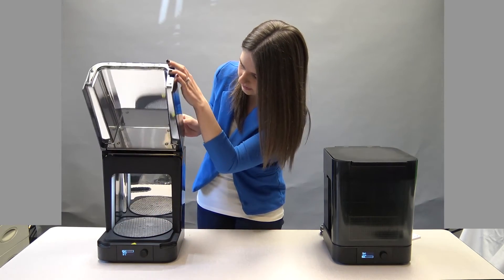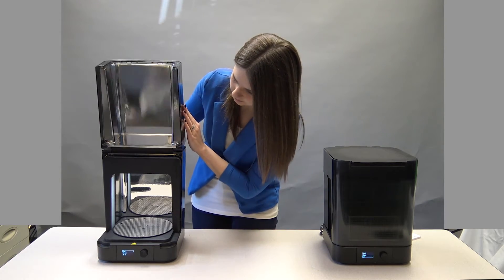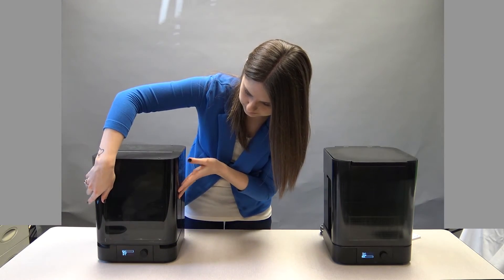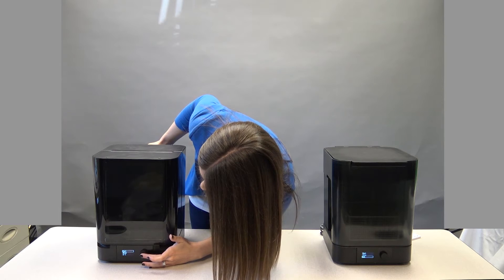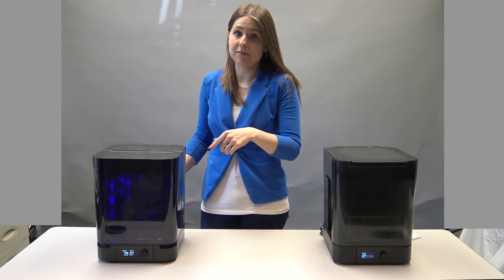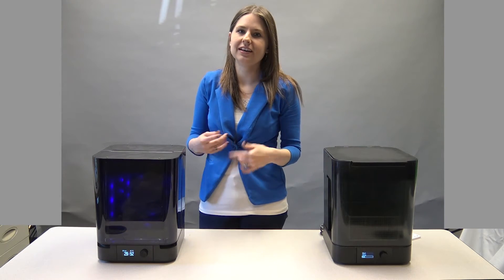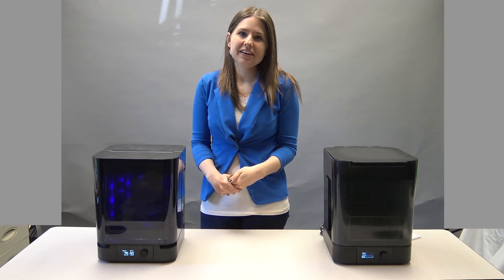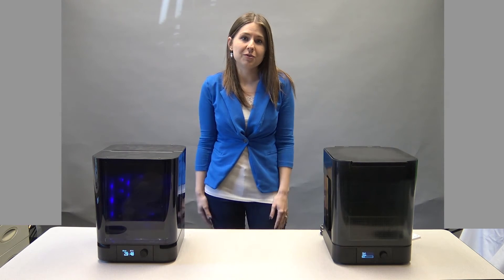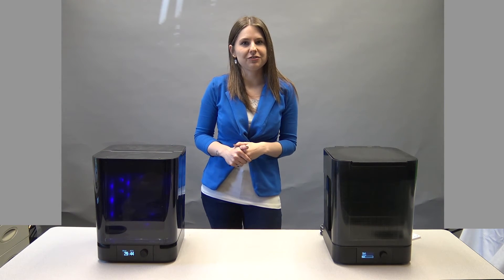To load it, just open the front like this, lay the parts right inside, close it, and hit start. It's turning on automatically because it was already running and warmed up. If you're just starting it, it might not glow right away because it has to heat up. That's about it for the Form Wash and Form Cure — for more information, give a call to your sales rep.